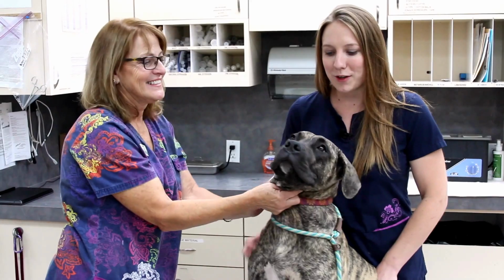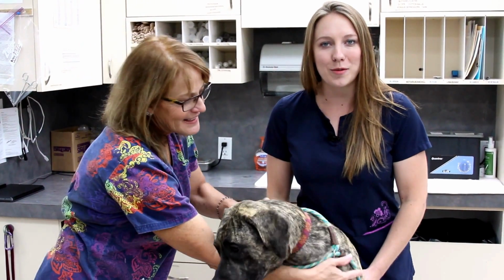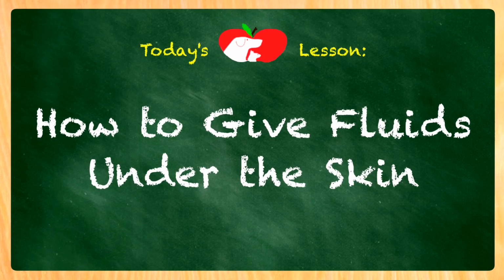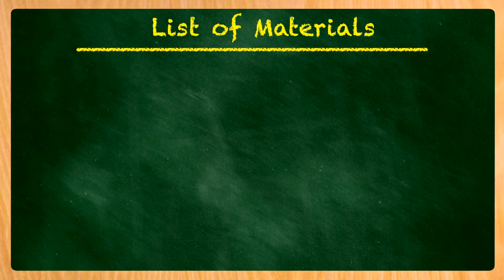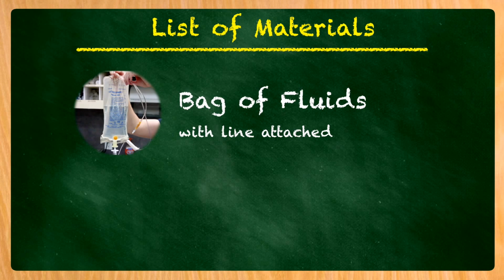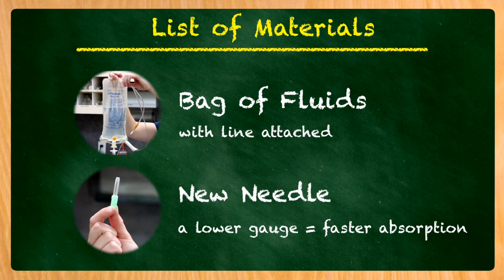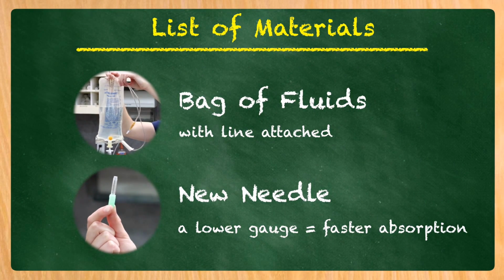We're both technicians here at Union Lake Veterinary Hospital, and today we're going to use Tiara to show you guys how to give sub-Q fluids. So what you're going to need for the sub-Q fluids is the bag of fluids that your veterinarian prescribes to you. There should be a line already attached to the fluids, and then you're going to use a new needle every time you give the fluids.